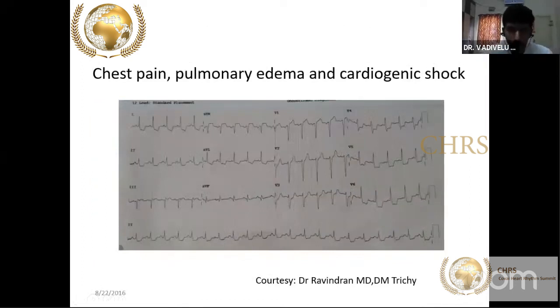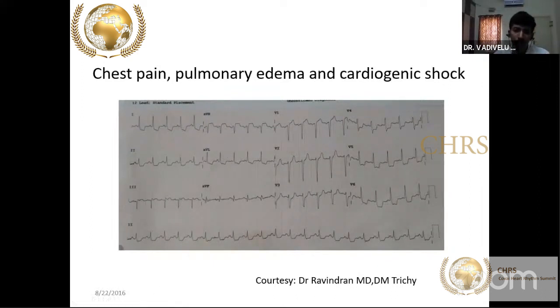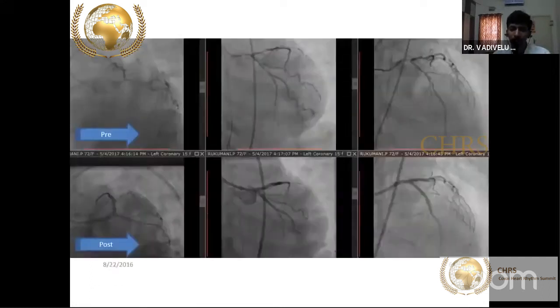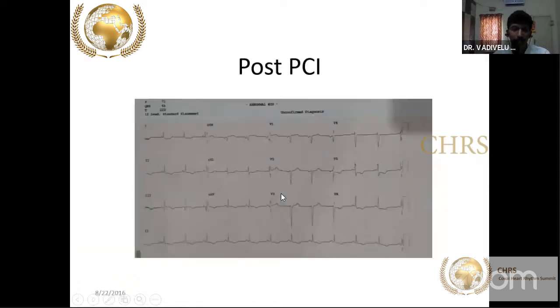Another patient with chest pain, pulmonary edema, and cardiogenic shock. ST segment depression in almost all leads — lead I, AVL, V5, V6, II, III, AVF — but ST elevation in AVR. If you have diffuse ST segment depression in all leads except AVR where there is ST elevation, you must think of LMCA or triple vessel disease. Angiography confirmed critical left main stenosis of 70–80%, with LCx and LAD also diseased.